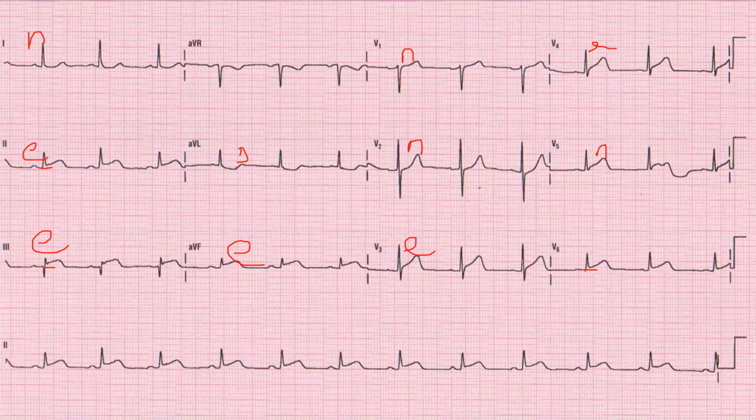All right, we have finished the discussions on identifying STEMI using the 12-lead ECG. Remember now that whenever you have a significant ST elevation, part of ACS protocol is also obviously to look at biomarkers in order to confirm the diagnosis of myocardial infarction.